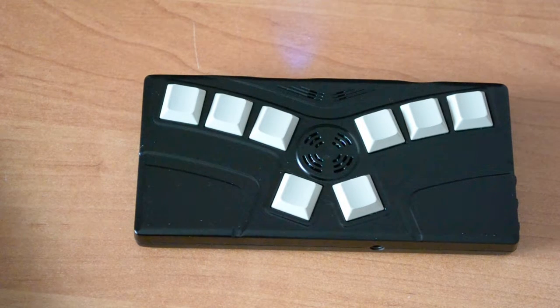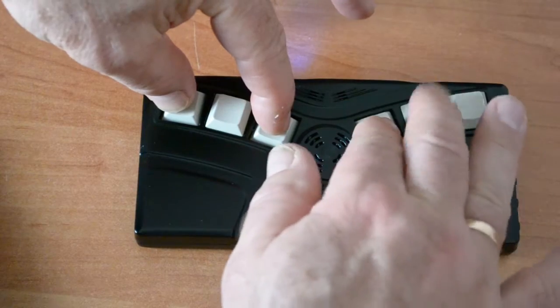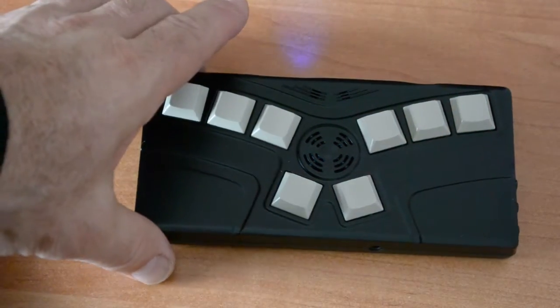And again we have the question, do you want to add a new device to the list? We answer yes, so the letter Y for English yes. Dots 1, 3, 4, 5, 6. Start the connection process on the external device. And now we have to start the connection process on the external device.